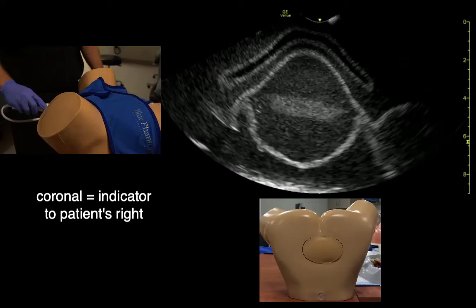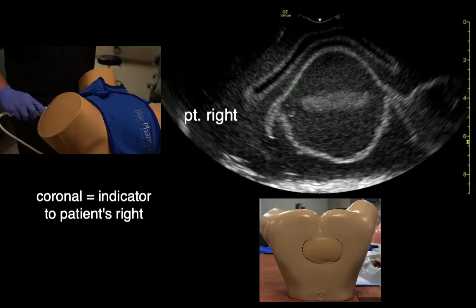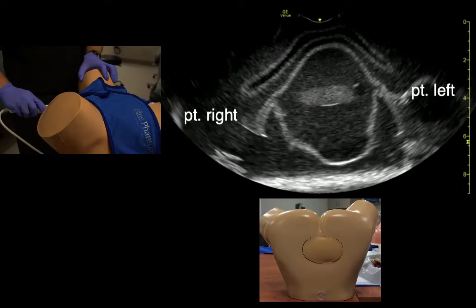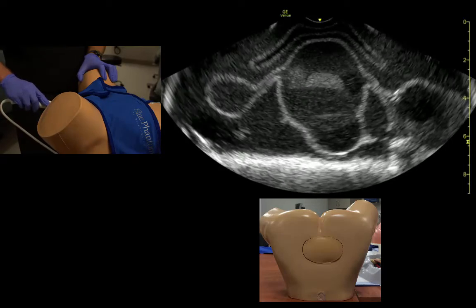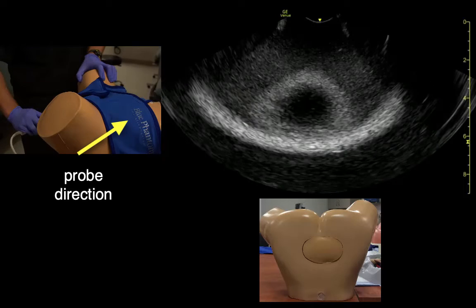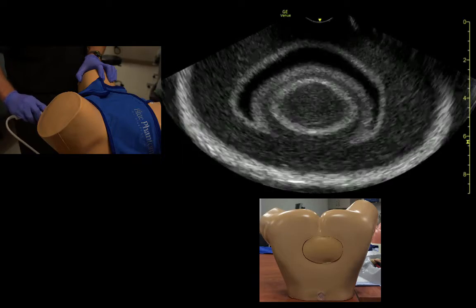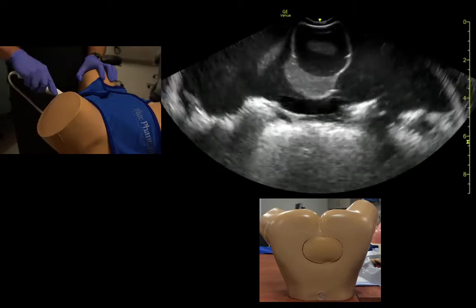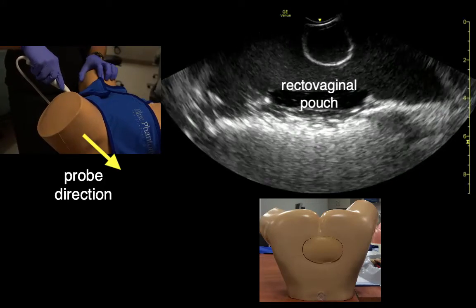In coronal view, the indicator is now towards the patient's right. What we see is the patient's right on this side of the screen and the patient's left on the other side. Our examination is now fanning from ceiling to floor. As we point the probe towards the ceiling, we see the bladder up here, and as we fan down through the uterus and point the probe to the floor, we see the posterior cul-de-sac — and this is the simulated free fluid in the cul-de-sac.